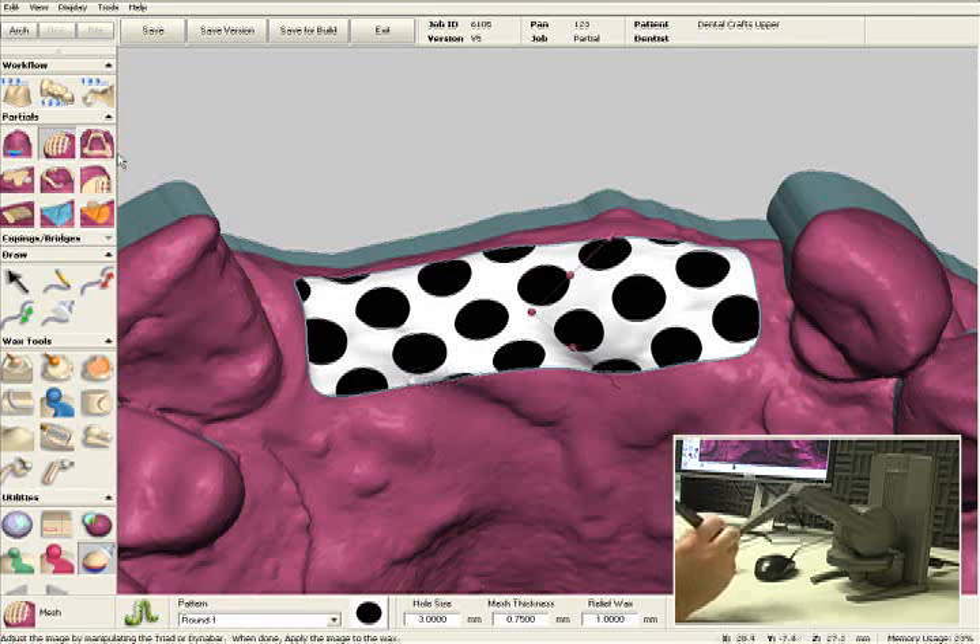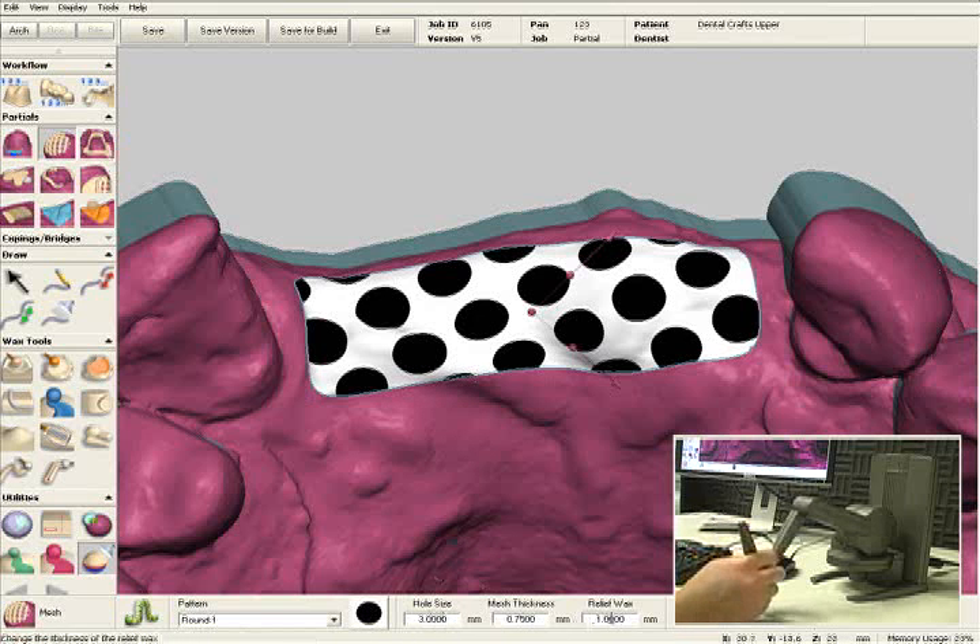The system comes with mesh patterns. You can modify them, or you can create your own. You can also preset your preferences for the mesh. You can preset hole sizes, mesh thickness, and relief wax thickness.